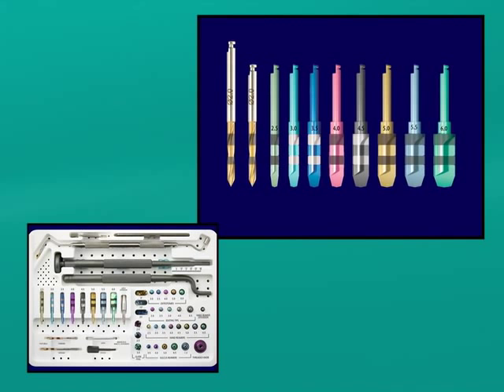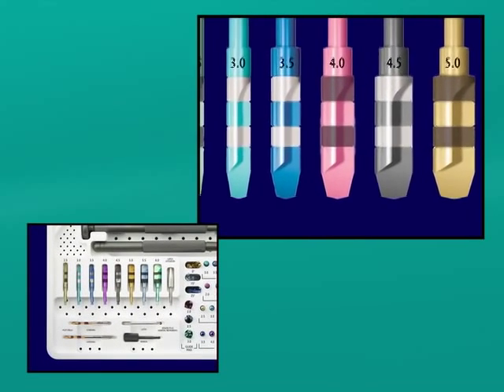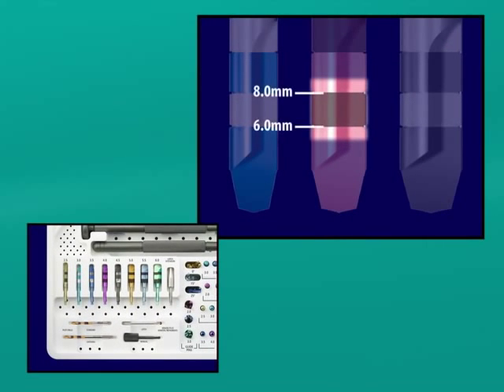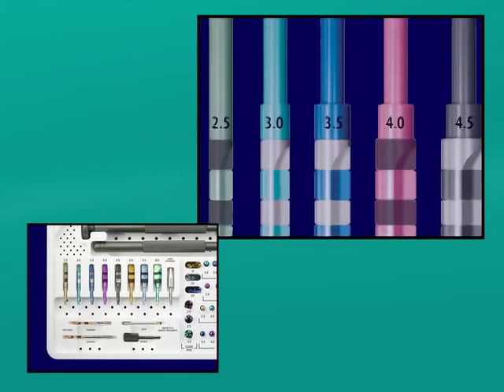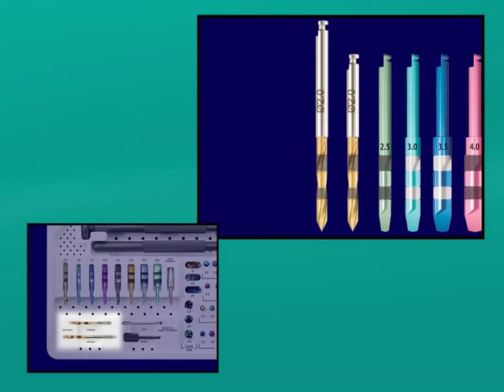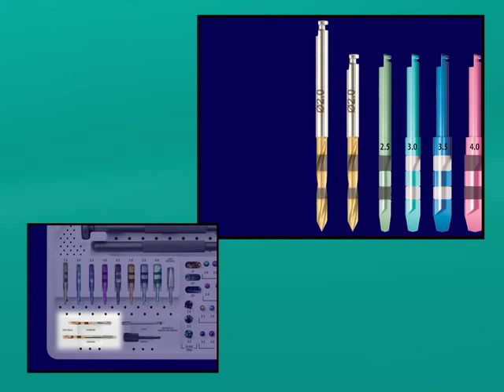The Bicon drills and reamers that we will be using have an initial band marking that starts at 6 millimeters and ends at 8 millimeters from the tip of the burr, with the second band marking spanning the 11 to 14 millimeter distance from that tip. Please note that the Bicon pilot drill is available in two lengths: the standard length of 32 millimeters and the extended length of 40 millimeters, which eliminates the need to attach the pilot drill to an extender when access is limited. The band markings are identical on both pilot drills.